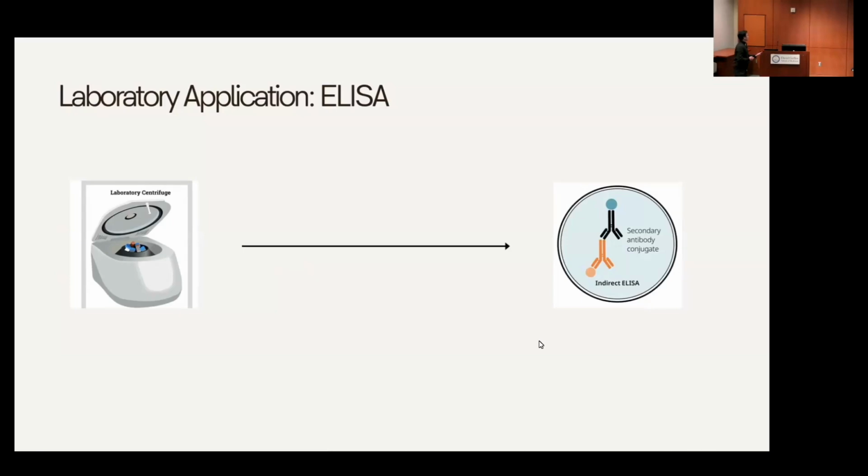Now that we're in the lab, we discussed in another video that we had the 4 subtypes of the ELISA reactions. Because we're interested in the presence of IgE, we want to use the indirect method because that's the only one that's capable of detecting antibodies. So first, now that we have the blood sample in the lab, we're going to want to go ahead and centrifuge it, and we'll let it clot to isolate the serum.